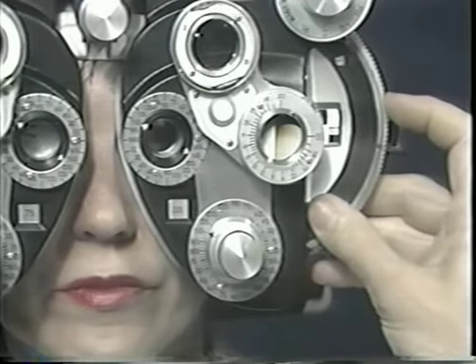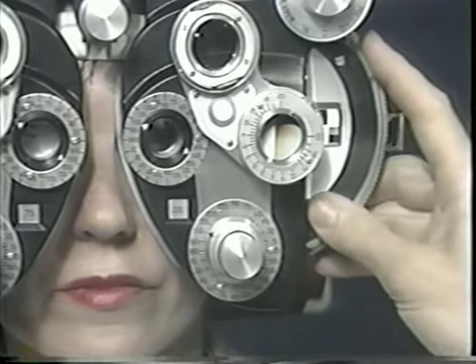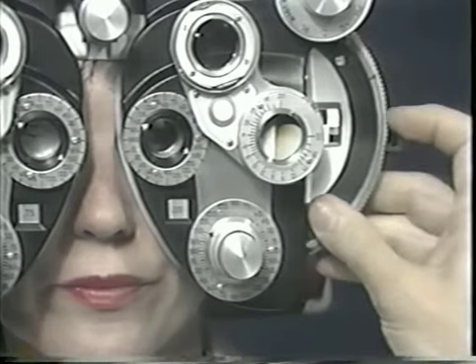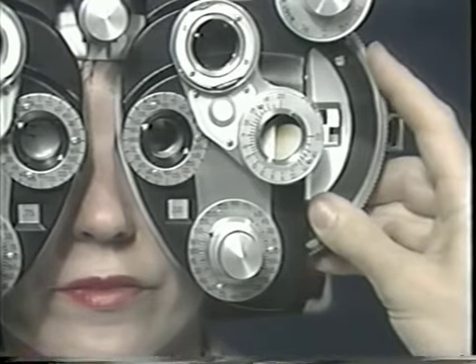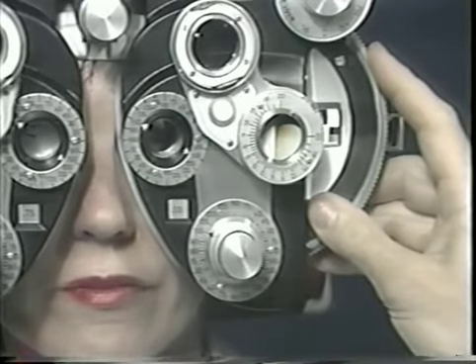Better or just smaller and darker? Ready? There. That's better. Okay. Again, still better or just smaller and darker? Ready? There. Better. How far can you read now?